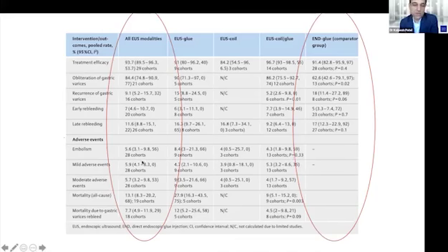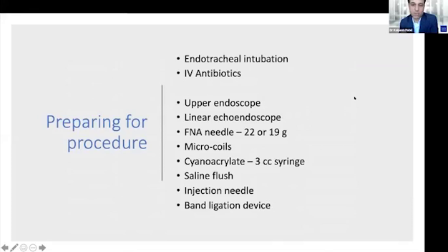And then in terms of embolization rates, the literature was very spotty on direct glue use, but in terms of the within EUS, the combination of coiling and glue is superior to glue alone. So again, some evidence to support that.